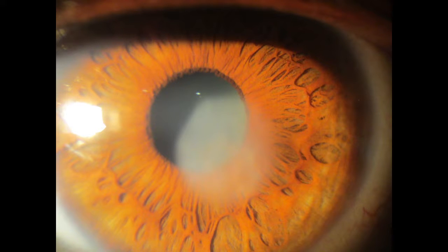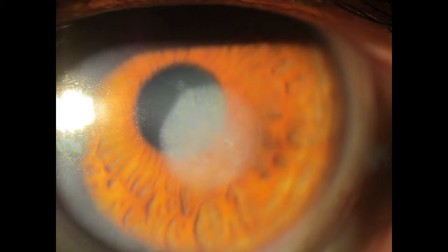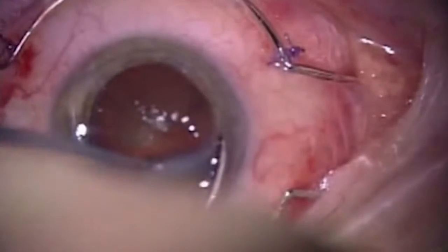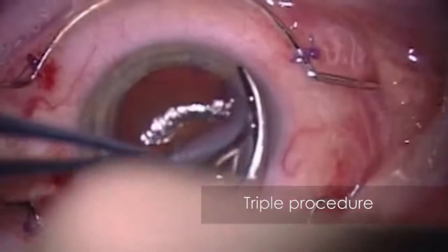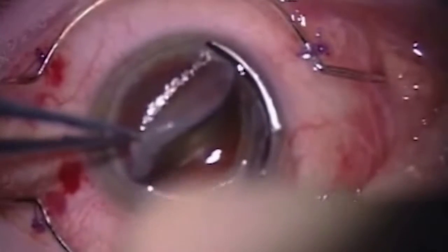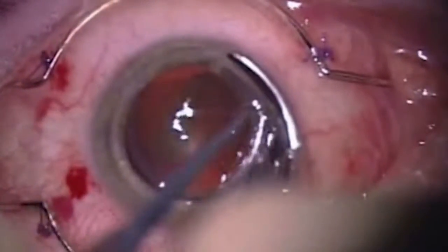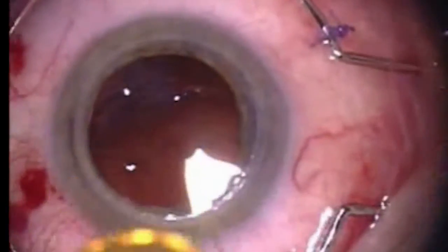Surgeons face a big challenge when treating patients with cataract and corneal comorbidities. Hopefully, current techniques for optimizing visual outcomes in these patients are readily available. If a patient's scar requires a corneal transplant, treating the cornea first, the cataract first, or doing a combined triple procedure each have advantages and disadvantages. Usually, surgeons tend to operate first on the factor that most affects vision, and if they have equal contribution, a combined triple procedure becomes the most appropriate choice.